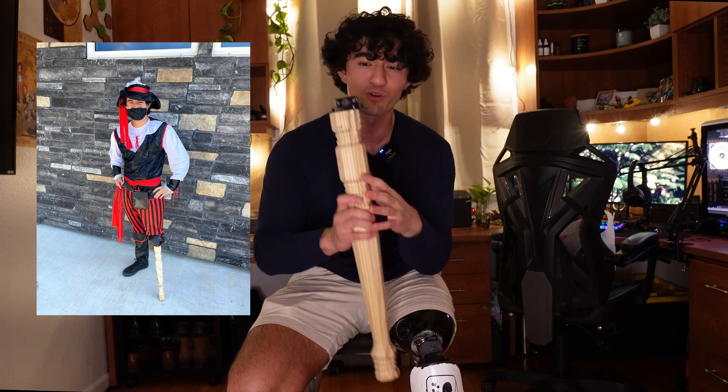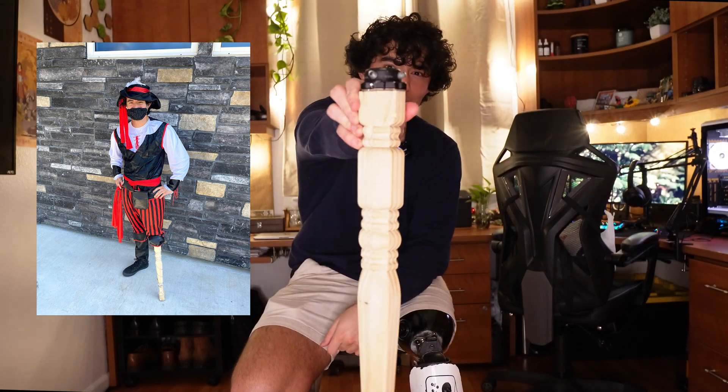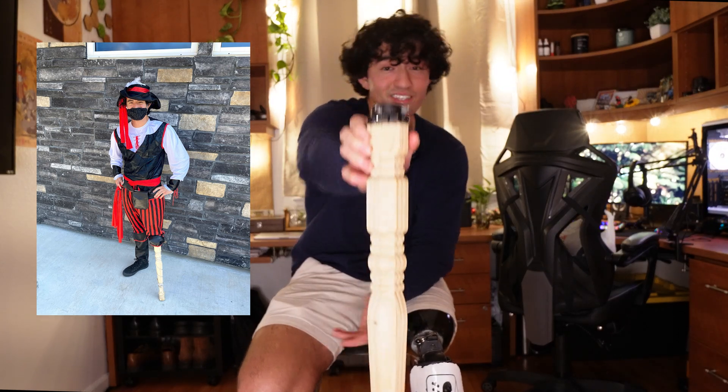The first prosthetic we have to talk about is the classic peg leg — an all-time classic. It cost me about $10 to make myself, actually from a corner piece of a table. The screws barely stayed attached and popped out when I put my weight on it for the first time. These are not reliable at all. Whenever you sit, it just pokes out — you can't really bend it. I don't know how pirates did it back then, but it probably wasn't great.